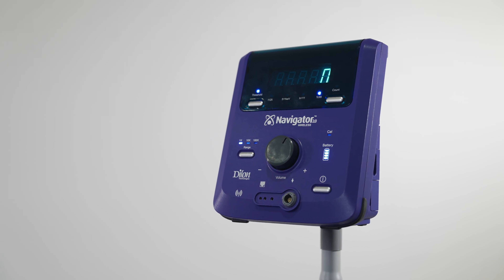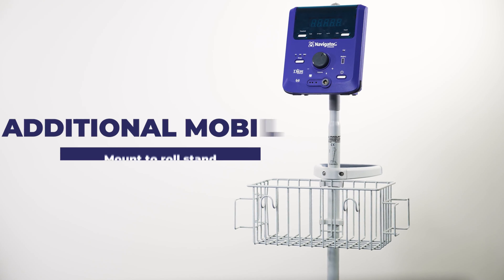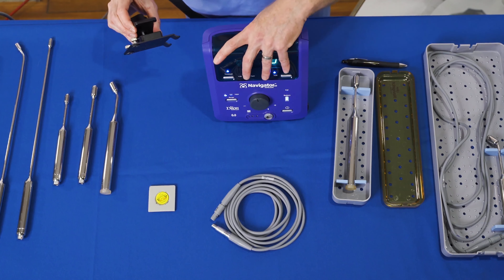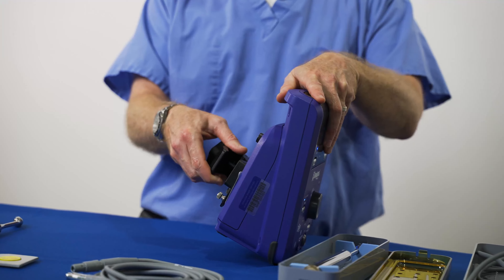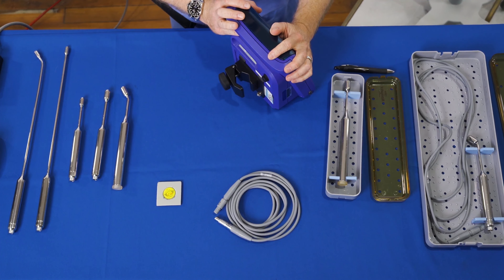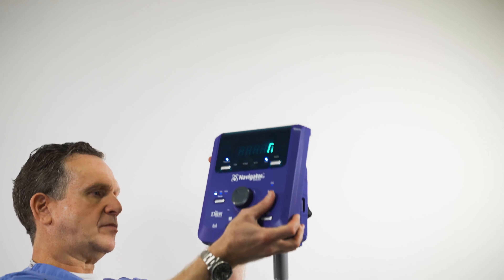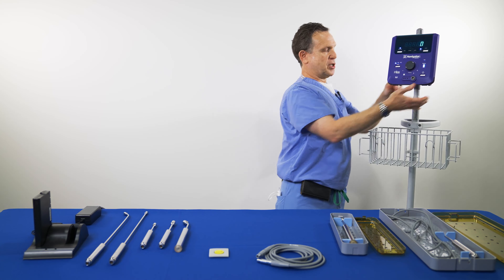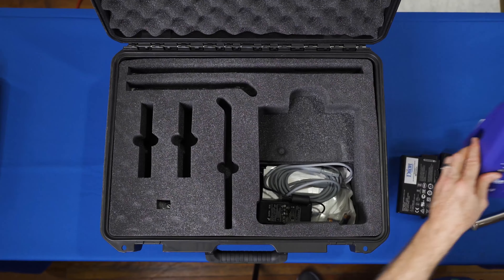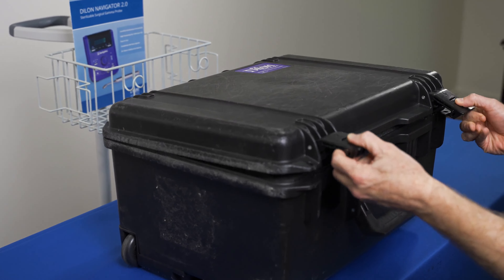The control unit has an anti-glare display with high LED visibility, which makes it easy to see from anywhere in the room. For additional mobility, the control unit can be attached to the Navigator roll stand. Attach the pole clamp to the control unit by inserting the top ears into the back of the unit and gently screwing down the clamp. Open the knob, place the control unit to the desired height, and tighten it into position. Now you are ready to connect the probe. If you need to store or transport the system, you can use the custom-designed Navigator 2.0 storage and carrying case.